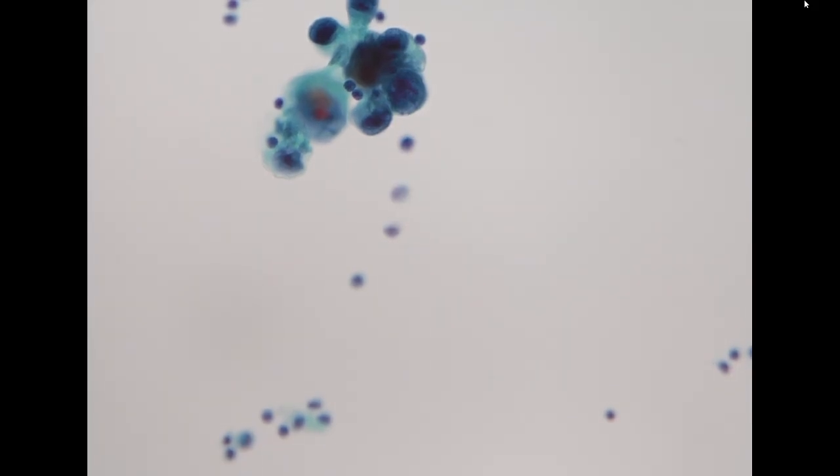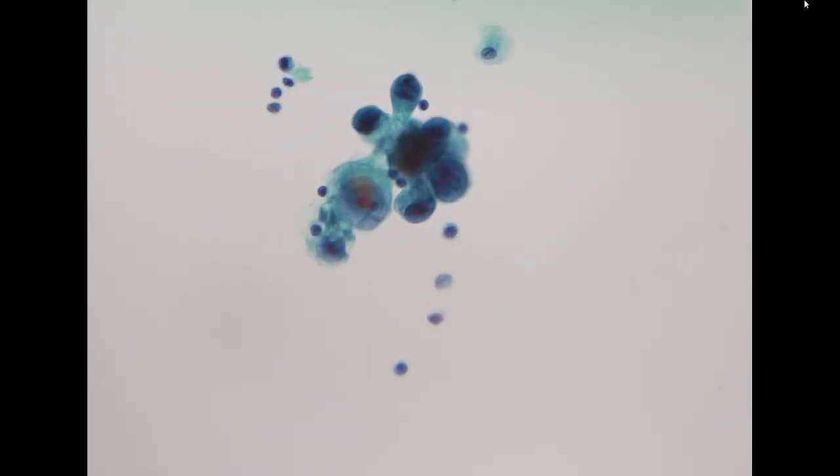So the morphology is different from the typical lung adenocarcinoma that we see, which has more abundant cytoplasm and a more vesicular chromatin pattern instead of this hyperchromatic and coarse chromatin pattern. So this is the pleural effusion specimen.